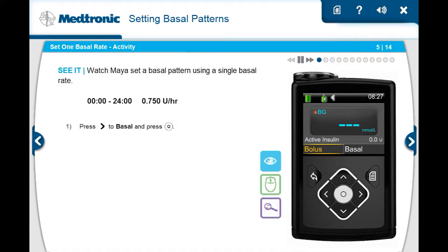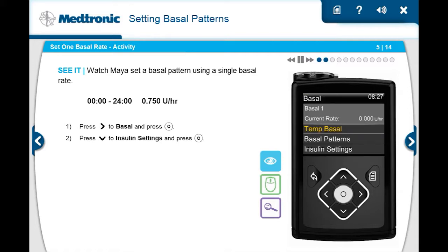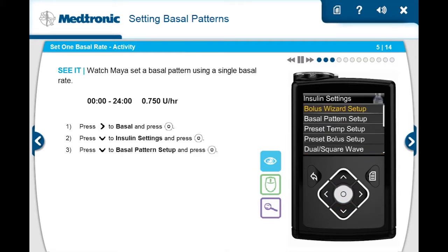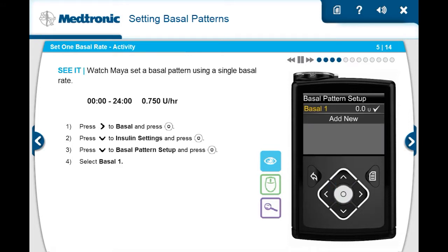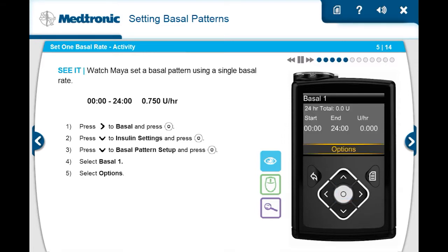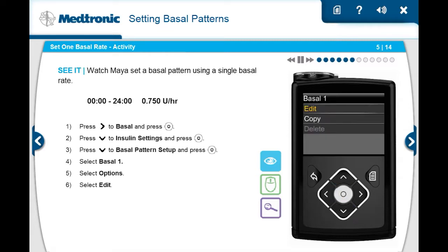First, she presses right to basal and then presses select. She presses down to insulin settings and presses select. Then presses down again to highlight basal pattern setup and presses select. She presses select on basal 1. She presses select on options, then selects edit.